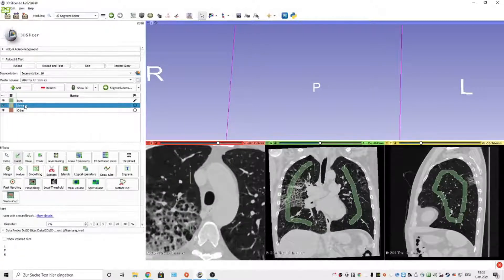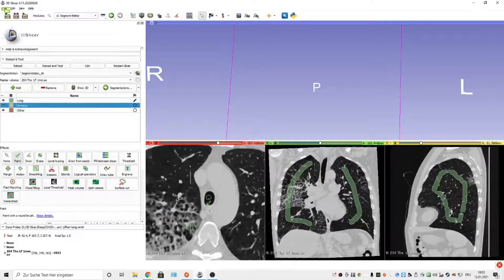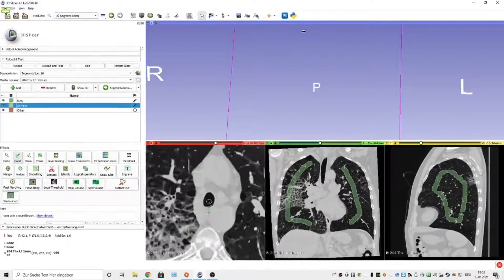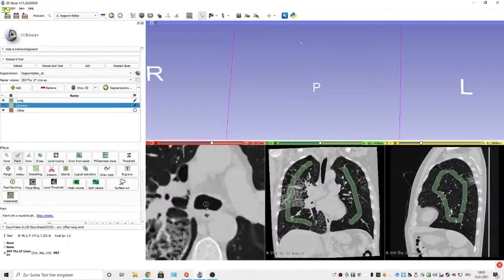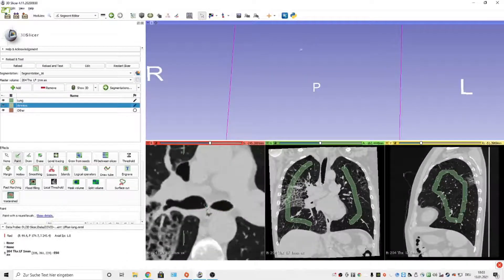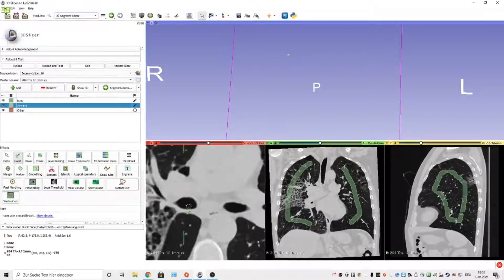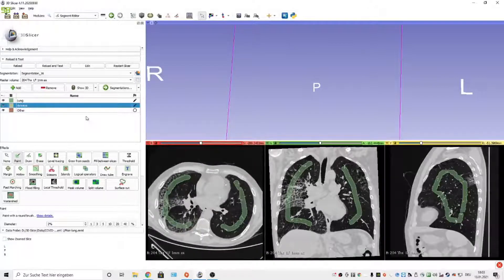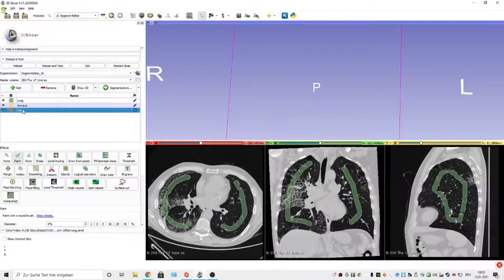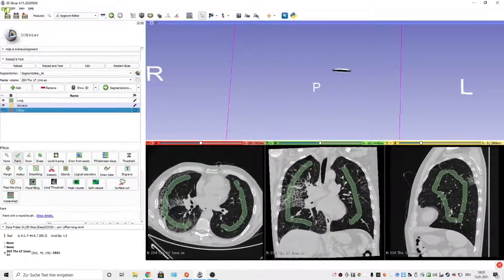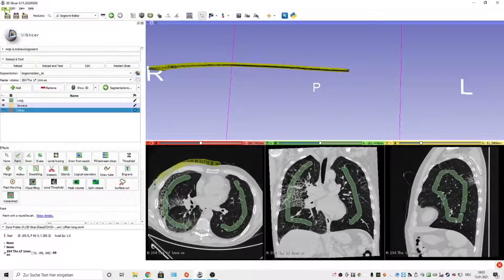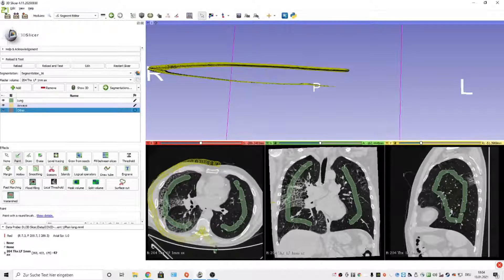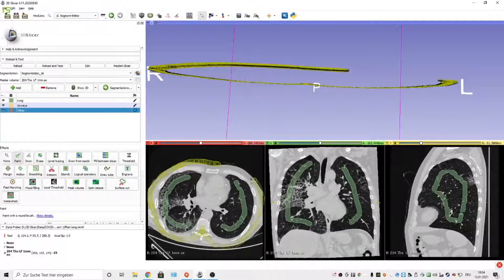Then I would go to Airways and drop a few drops of paint in the trachea, as well as in the main bronchi. Then I would go to Other and paint around the lung in all axes. The paint line must be continuous and should not have any interruptions, if possible.